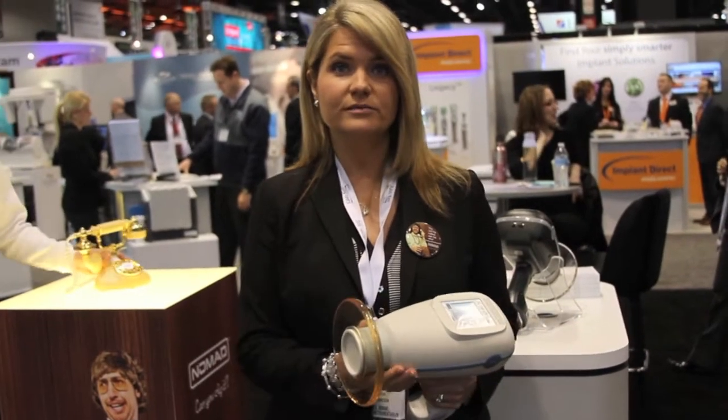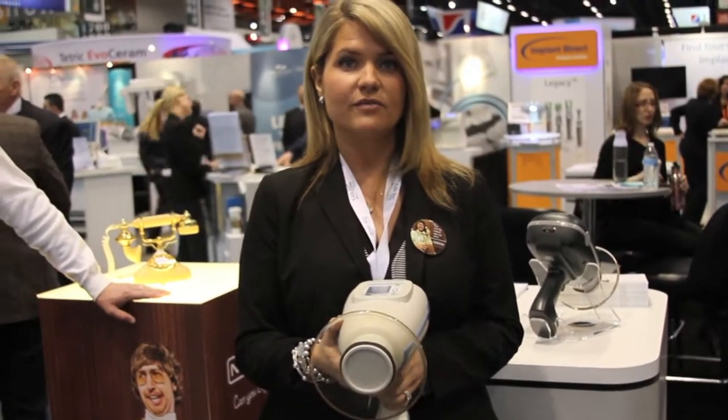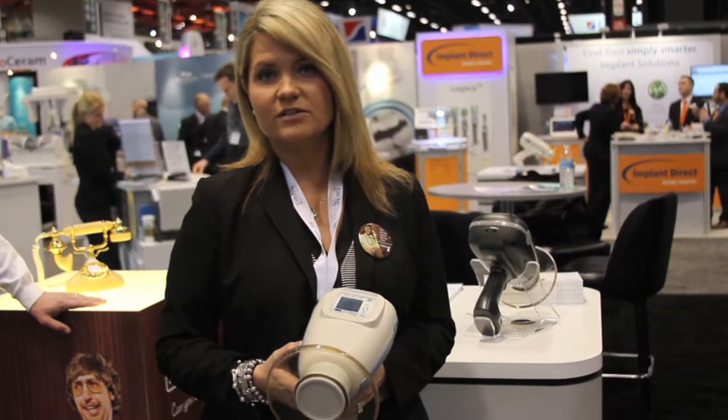Why? It's portable. It's lightweight. It actually weighs only a little over five pounds, and it's extremely portable. You're able to take it from room to room to room. So instead of having a wall-mounted x-ray in every operatory, now you have one Nomad for two to three ops. So it makes it very cost-effective.